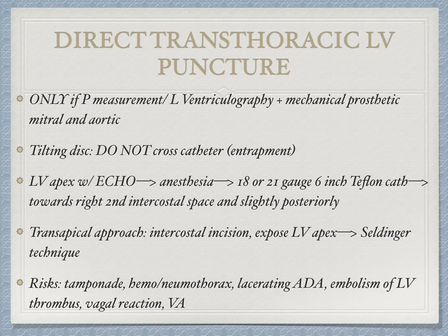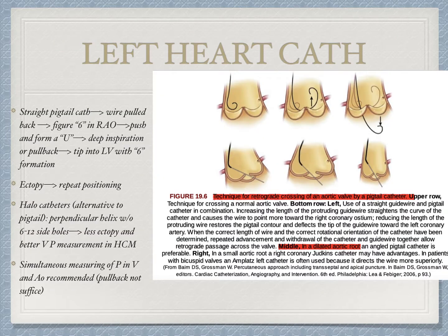What are the risks? Many: tamponade, hemothorax, pneumothorax, lacerating the left anterior descending, embolism of left ventricular thrombus, vagal reaction, and ventricular arrhythmia. For left heart catheterization, first know what's normal. The normal is the upper row.